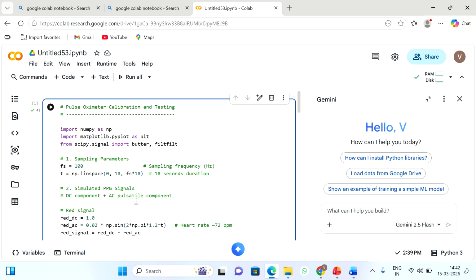1.2 hertz is normally the heart rate frequency. Since 1.2 hertz is per second, when it is converted into minutes, it is 1.2 times 60, that is 72 beats per minute. So the heart rate is equal to 72 beats per minute. And then 0.02 is small in amplitude, that is the pulsating part. Then the final red signal is equal to DC plus AC.